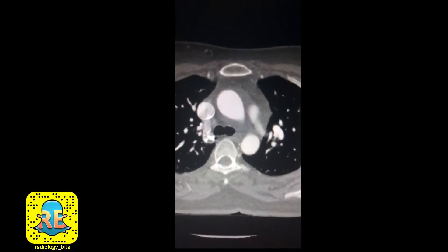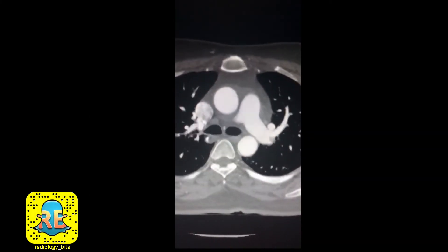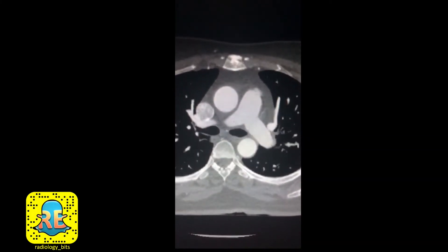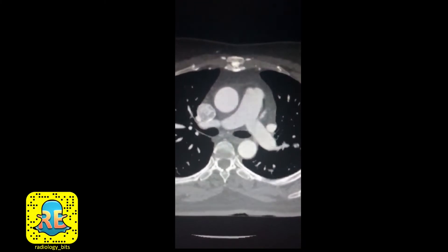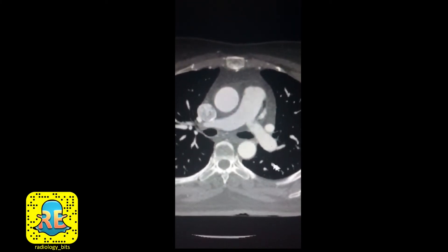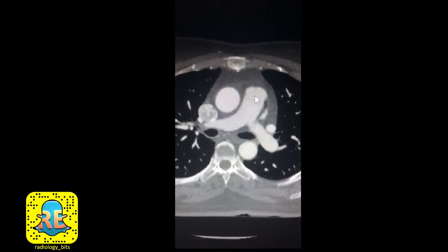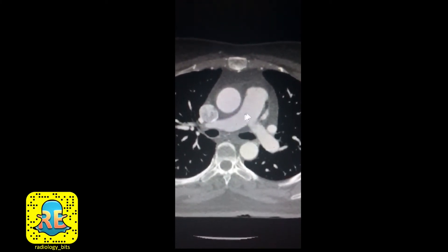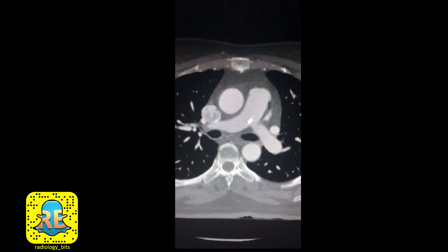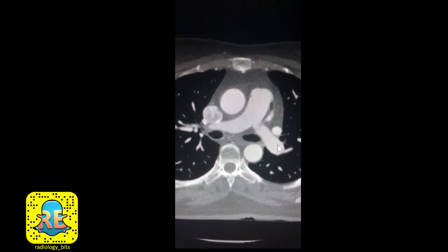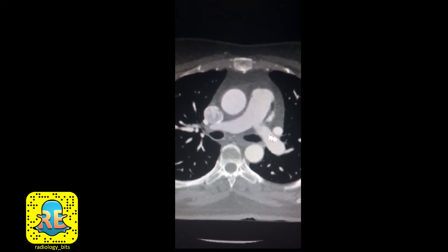As we scroll from above to below, you can follow these structures. Concentrate on the pulmonary artery — this is the pulmonary trunk, this is the right pulmonary artery, and that's the left pulmonary artery at the bifurcation.